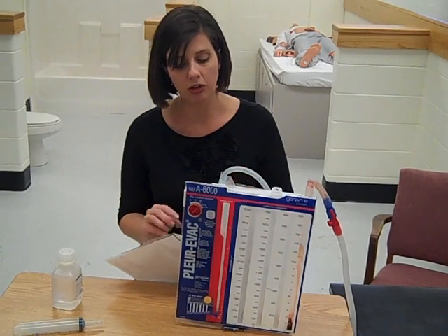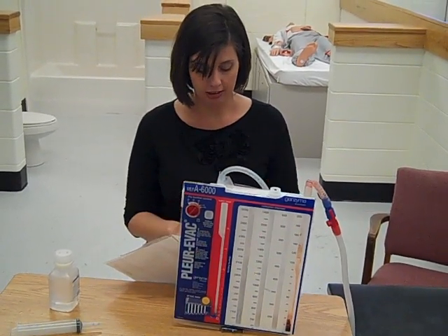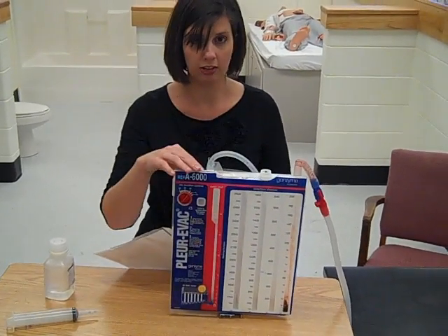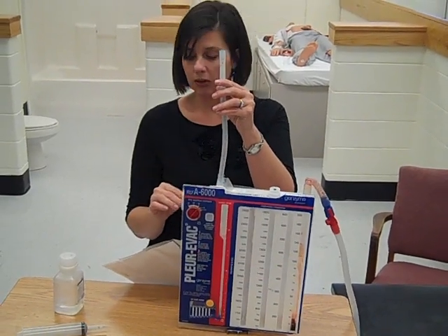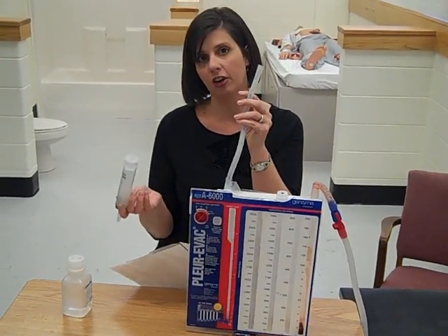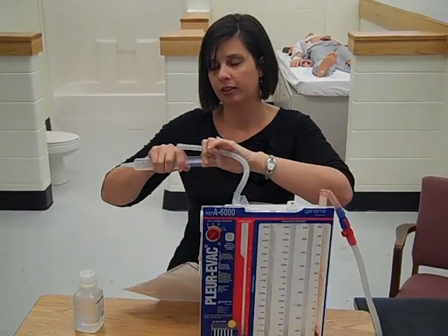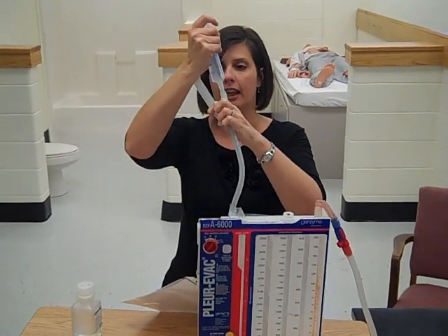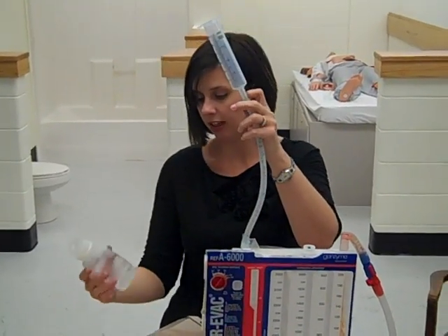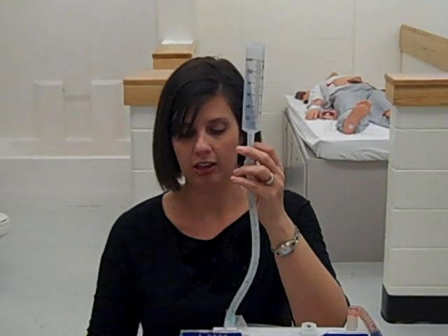Basically, what you would do is you would open the package sterilely, and you would take out the device and you would turn this little foot piece so that it could stand upright. You would take this tubing right here and hook it with a funnel or a sterile syringe that came in the packaging with it. Pull my plunger out here, like so. And you would add 70 milliliters of sterile water. Okay, not tap water, sterile water. So you pour 70 milliliters into here.